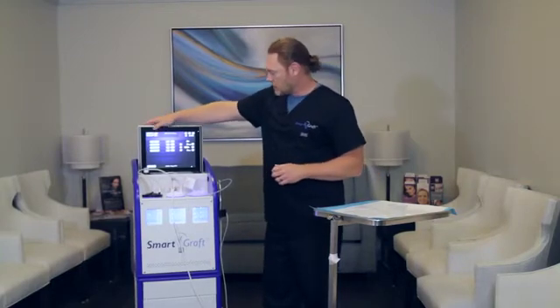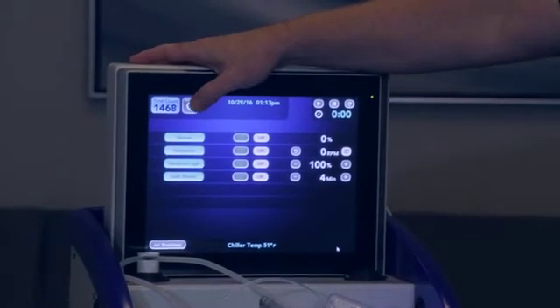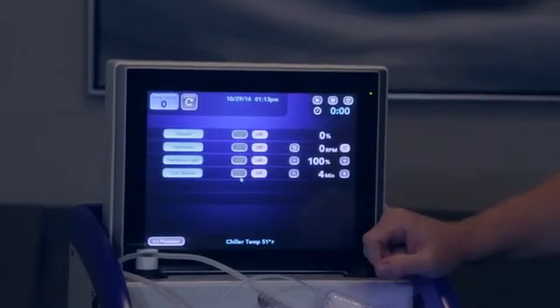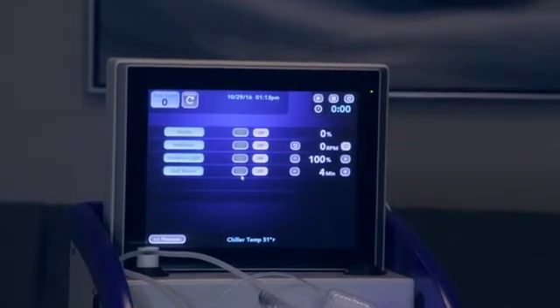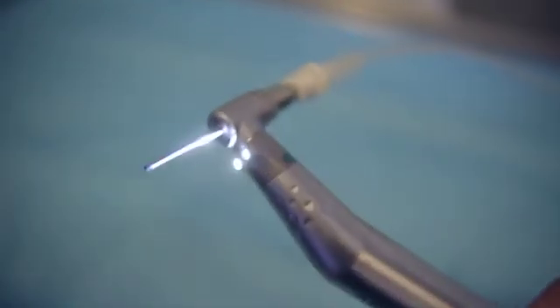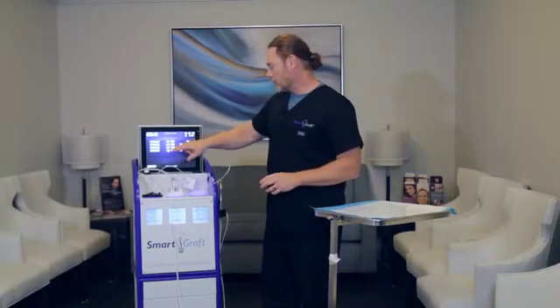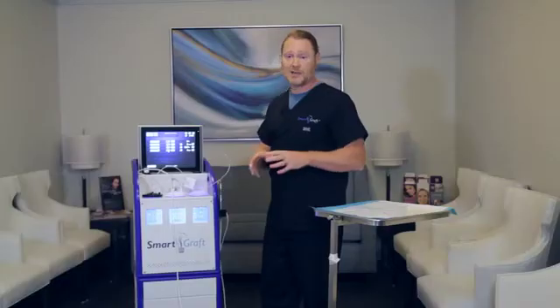You'll see over here it actually does have a graft counter. To clear this — there is a number there from a previous case — you would just hit this button and it would ask, are you sure that you want to clear the counter? You would depress yes. You have here vacuum, the handpiece motor, the handpiece light — which is actually an added function — it does provide a really good light source. You also have the graft shower that you can turn on and determine how often you want the saline to spray.